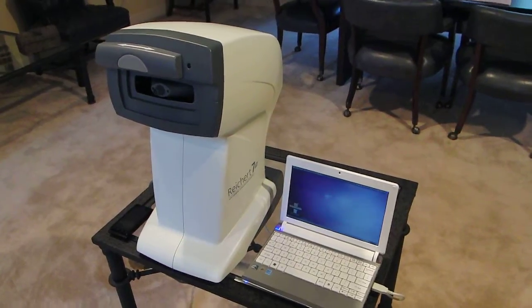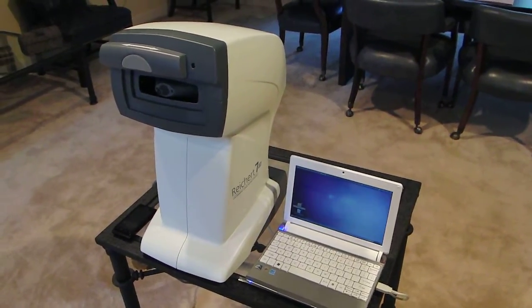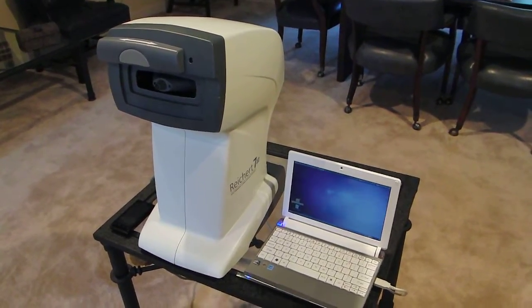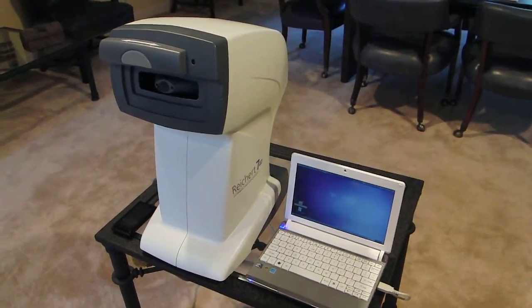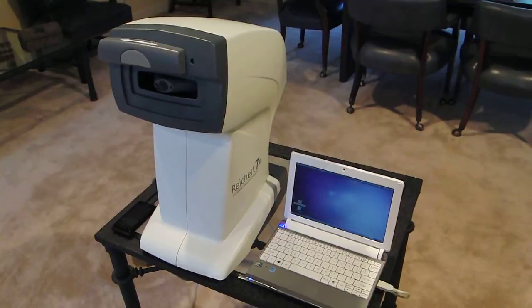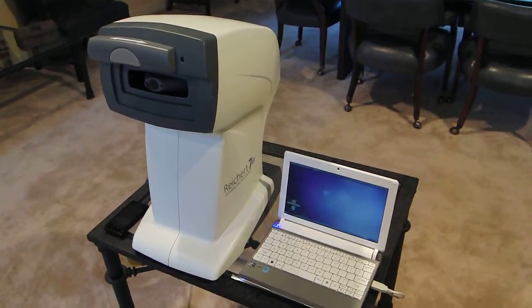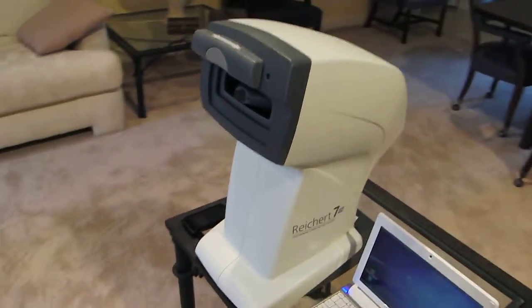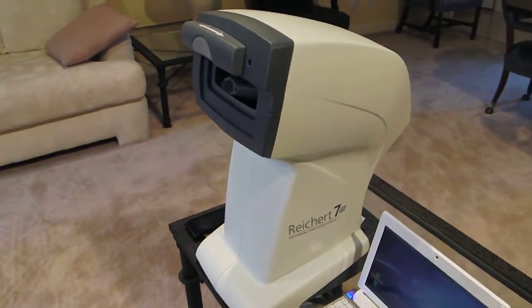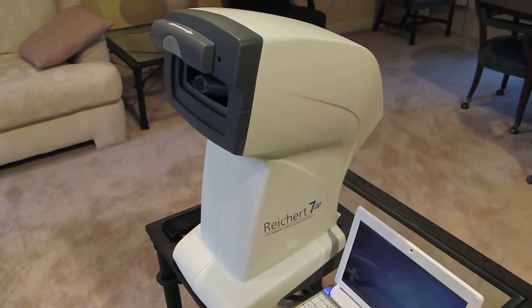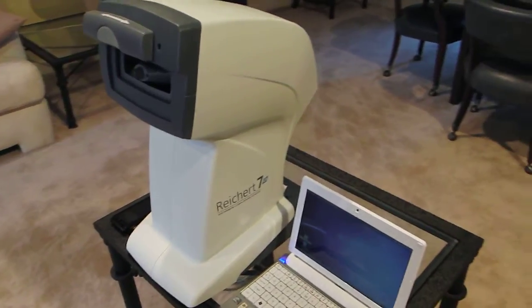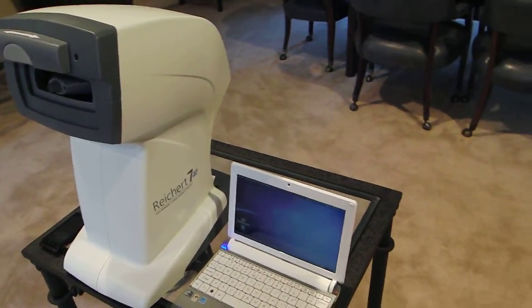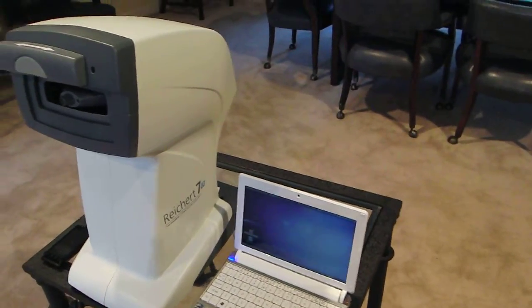Okay, in this video I will attempt to demonstrate self-tonometry with the Reichert 7CR tonometer and the FitEyes Insight application.